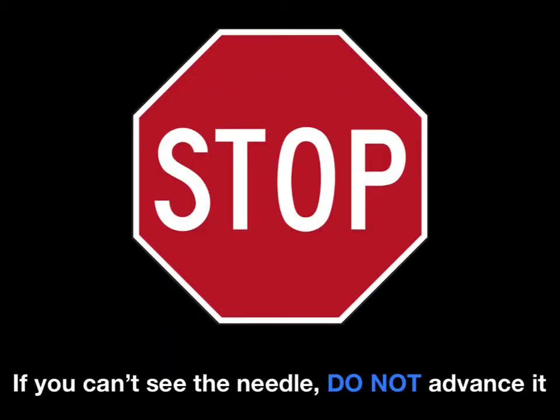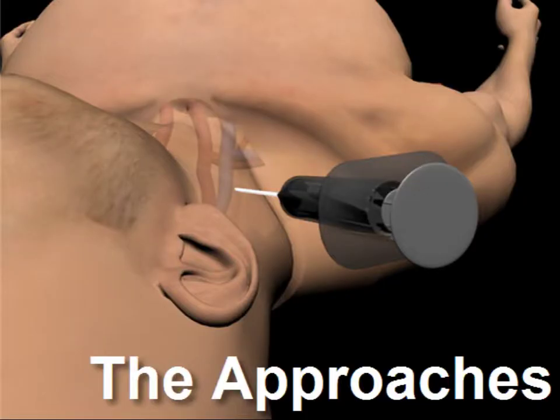I want to reiterate a key point here. For whatever reason, during whatever approach, if you can't see the needle, stop advancing it. You've got to make corrective movements with the transducer in order to visualize the needle. If after multiple attempts you still can't find the needle, the solution is never to advance it. Your best bet is to remove the needle and start again. Let's now look at some specific target vessel approaches.